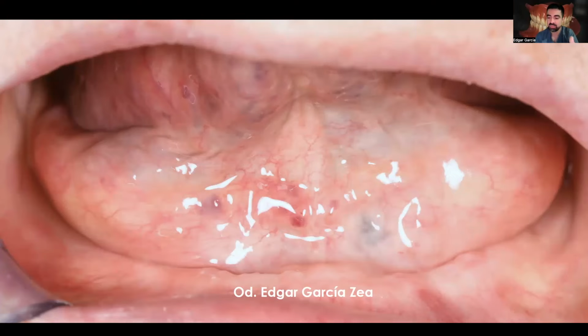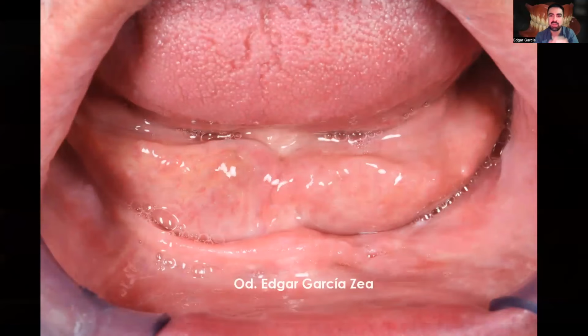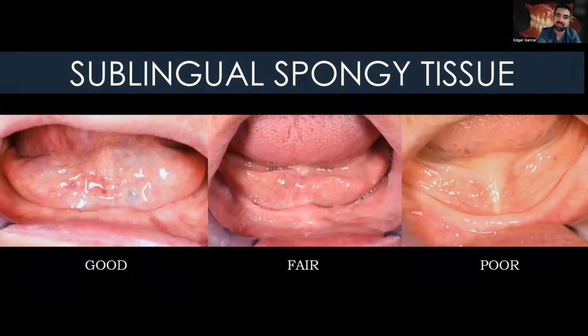So in this case, we have a good amount of spongy tissue, not like this one, but it's a good one. But look at the difference with this patient. We have a poor amount of spongy tissue. So we can classify this as a patient with a good amount of spongy tissue, a fair one and a poor one.